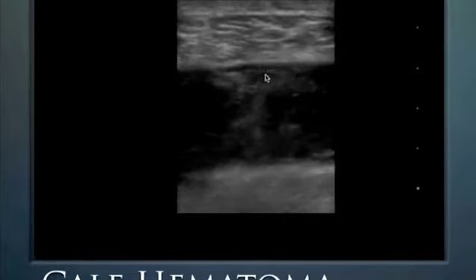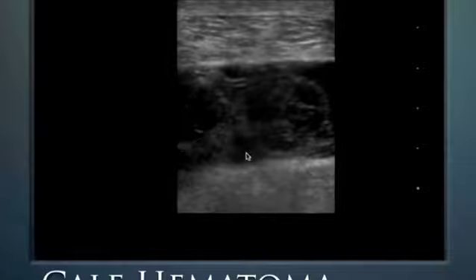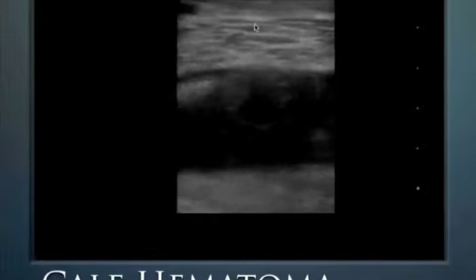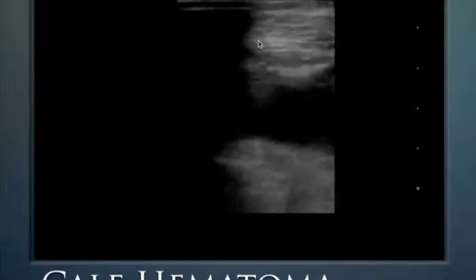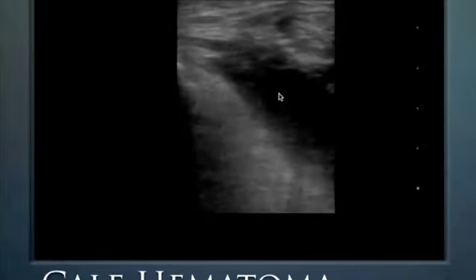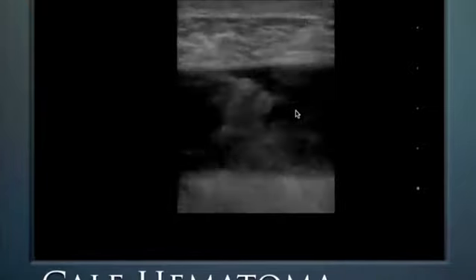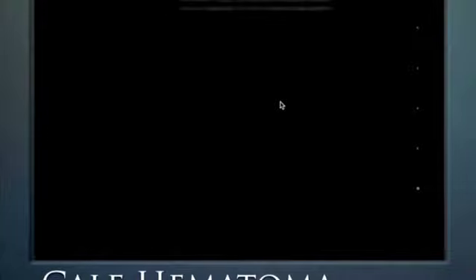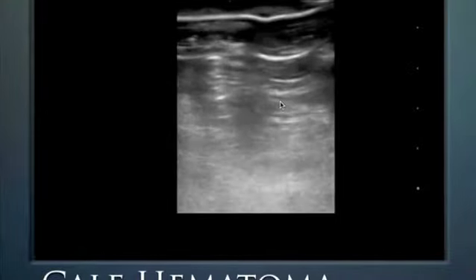And finally, some things look like abscess, but they're just hematomas. And that's what this looks like here. This is in the patient's calf. This is muscle we see up here. And this very hypoechoic area with some anechoic areas to it, this is what a calf hematoma looks like. It's all spreading out back here. And on the patient's skin, too, there's prominent ecchymoses seen as well.